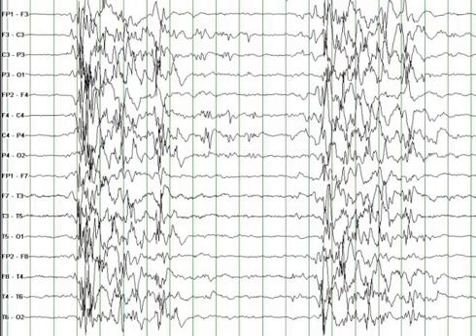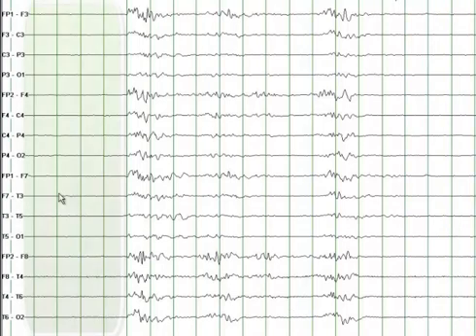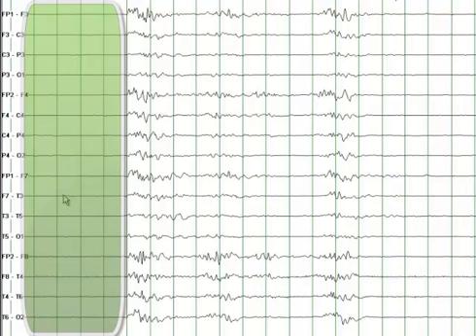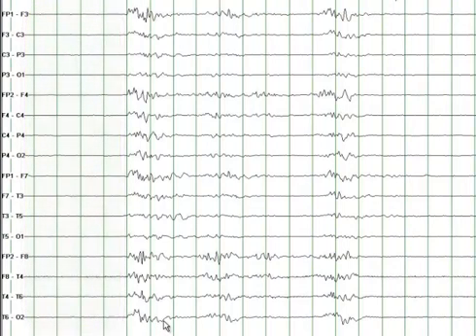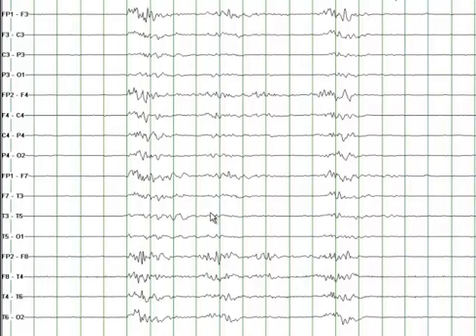Now I will show you an example of a person with burst suppression resulting from anoxic brain injury. This particular patient had anoxic brain injury resulting from a cardiac arrest that lasted for 20 to 30 minutes. You see periods of suppression with amplitudes less than five microvolts in a generalized distribution, and bursts that last for approximately two to four seconds with variable amplitude in different locations. In the absence of medication effect, a burst suppression pattern in the context of anoxic brain injury heralds a poor prognosis for functional recovery.